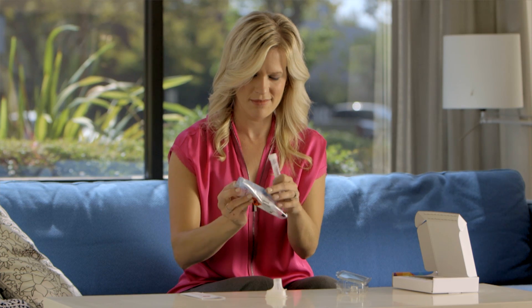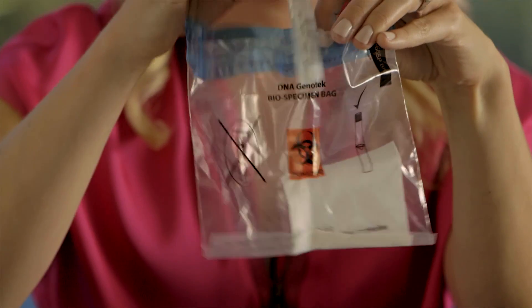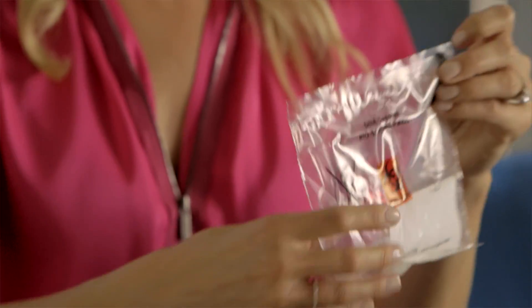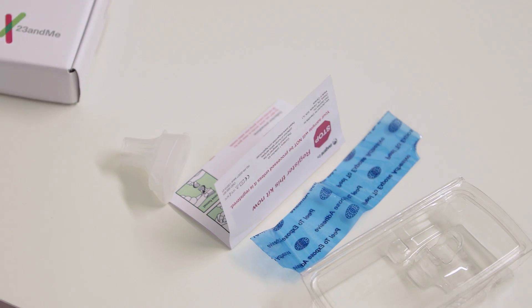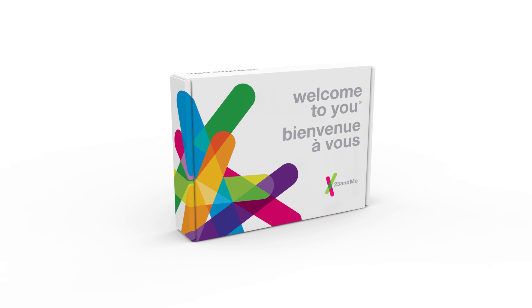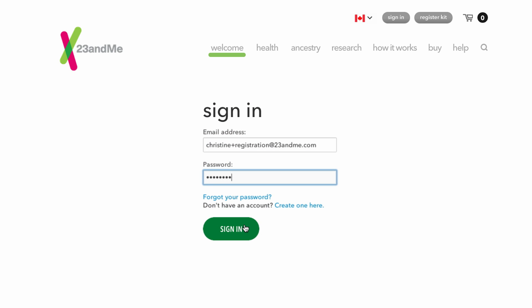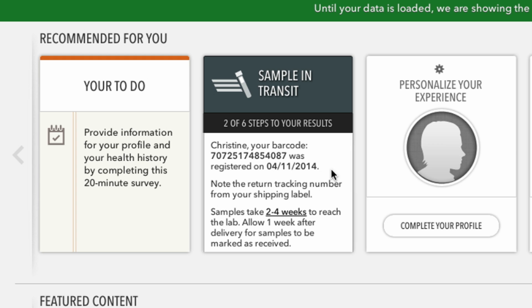Now your DNA is ready for transport. Open up the biohazard bag and place the tube inside. Remove the adhesive backing and seal the bag shut. Place the bag directly inside the box. The plastic clamshell, instructions, and funnel cap can all be discarded. Seal the box and place it in any Canada Post mailbox or take it to your post office. You can track the progress of your sample by logging into your 23andMe account and finding the sample status information located there.